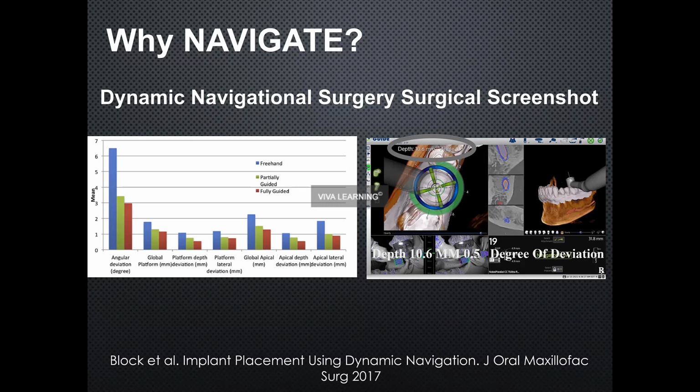So this also shows that we get to follow our bullseye. In this particular software, 9 o'clock is always going to be the finishing spot. So it's going to be yellow all the way to about a half millimeter from your final depth, then it'll turn green. And then you'll hear an audible click. You can also follow it in the 3 screens in the monitor as well, making sure you're right in your treatment planned implant.